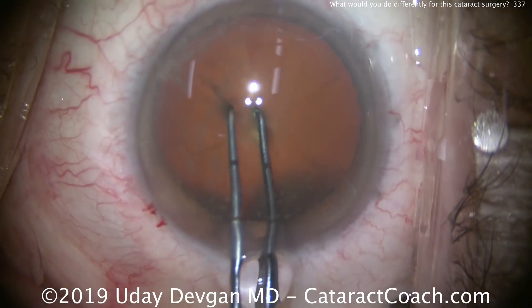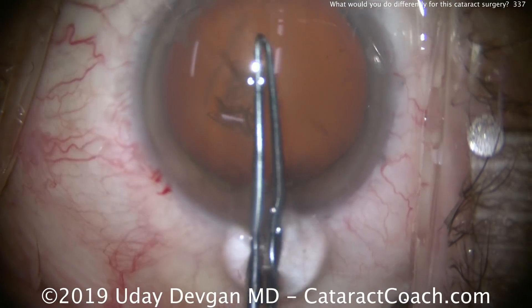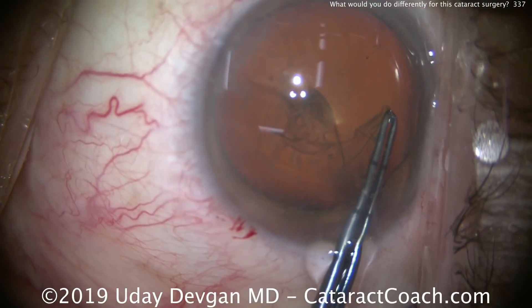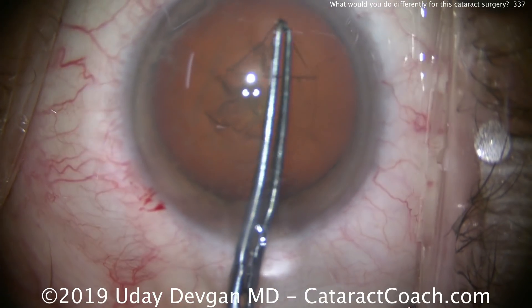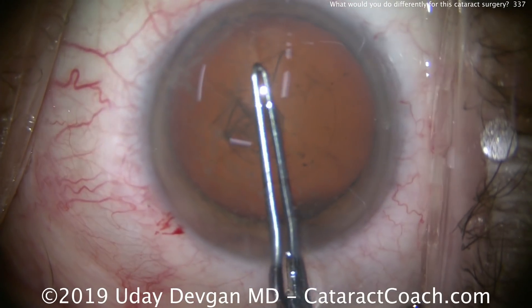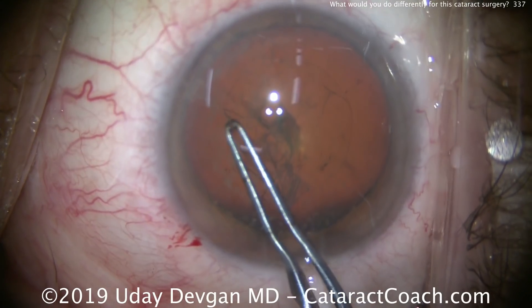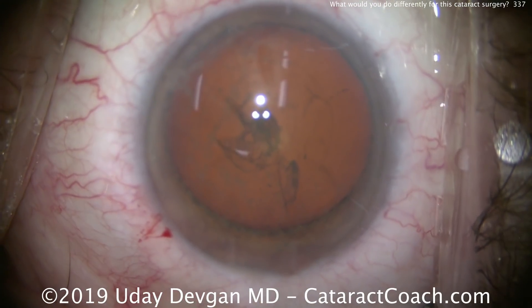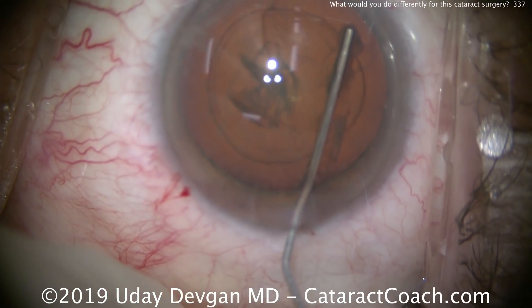We'll do the capsorexis. And in this patient, for the lens calculations — if you think the patient is never going to need an endothelial cell transplant, you can certainly aim for a plano outcome. If you think the patient is going to need an endothelial cell transplant in the near future, I encourage you to aim a bit more myopic — about minus 0.5 or minus 0.75 diopters post-op — so that when the endothelial cell transplant happens, that'll give a final refraction closer to plano. But in this case, I think the patient's going to do great and not need an endothelial cell transplant, at least for the next many years.